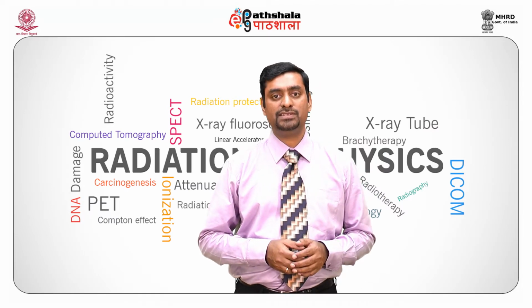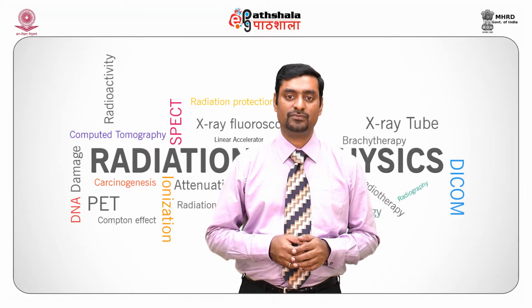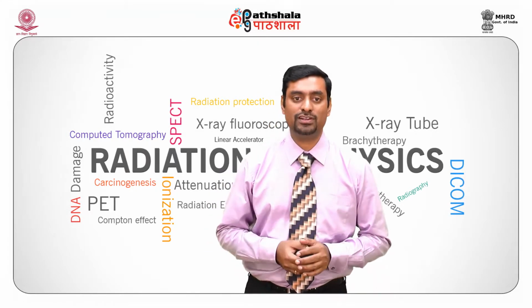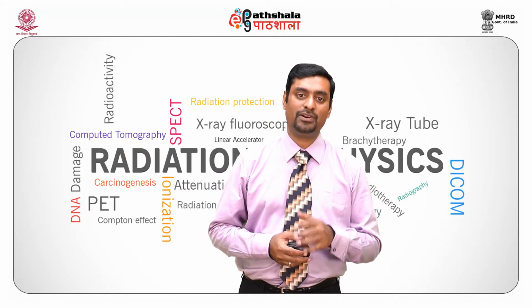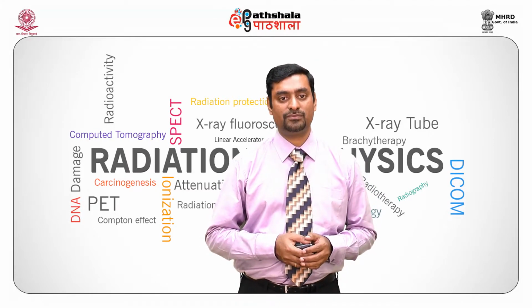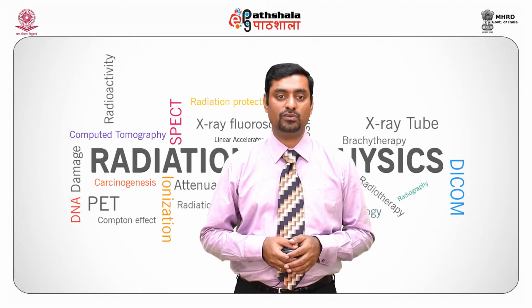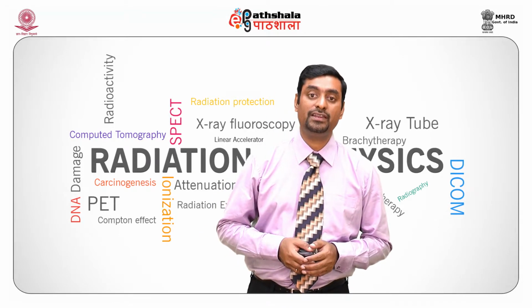Amorphous selenium is a semiconductor material which is placed between two electrodes. So, we are going to give power supply to these two electrodes. During an operation, when high voltage is applied across the electrodes, the high voltage serves to separate electrons and holes in order to avoid recombination.